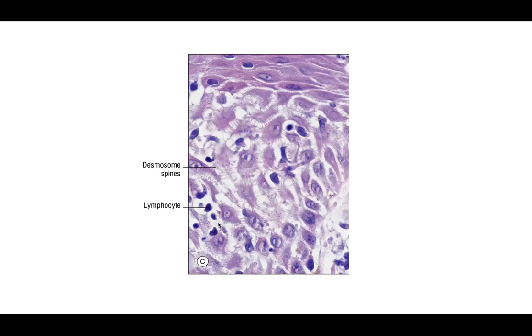Now, lymphocytes going into the epidermis could represent something bad like cutaneous T-cell lymphoma. But usually, when you have these normal appearing lymphocytes within a spongiotic epidermis, that's the result of exocytosis. And that happens kind of just by second nature with the inflammatory process. So many times you will see lymphocytes hanging out in areas of spongiosis.